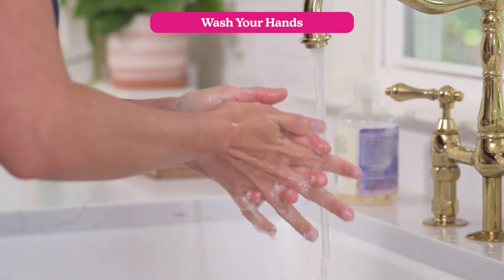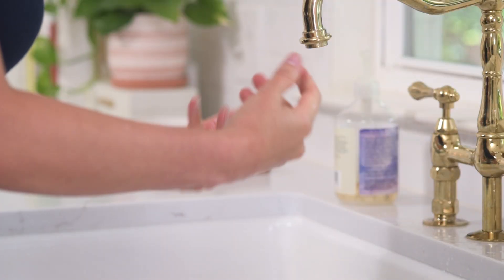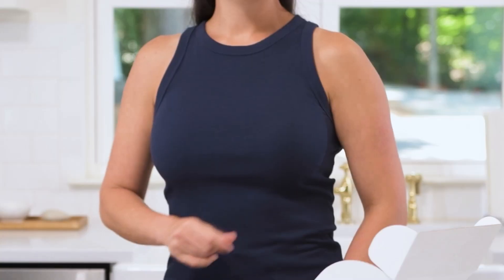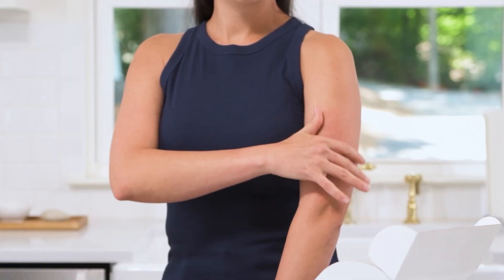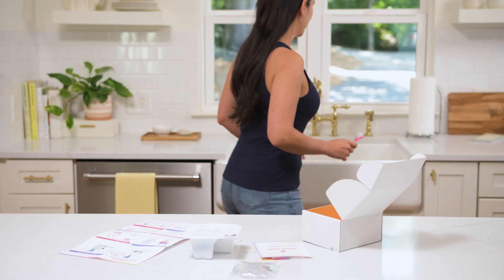First, wash your hands thoroughly and let them air dry to avoid contamination with male DNA. Don't use paper or cloth towels. Next, pick a flat spot on the outside of your non-dominant arm — that's your left arm if you're right-handed, or your right arm if you're left-handed. This is where you'll collect your sample.